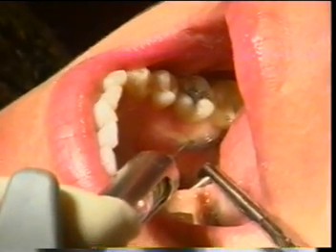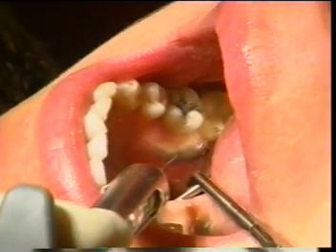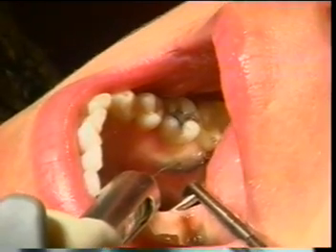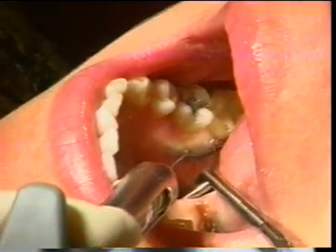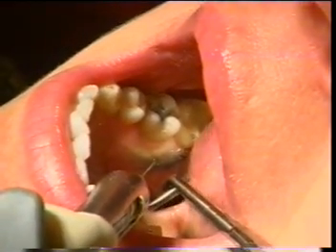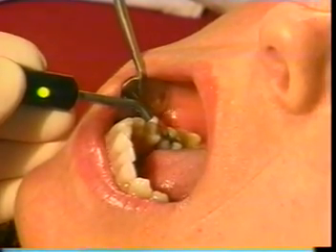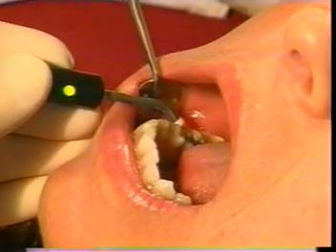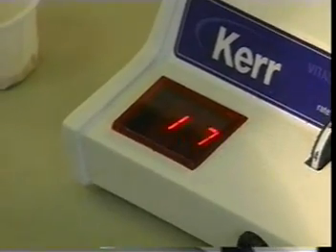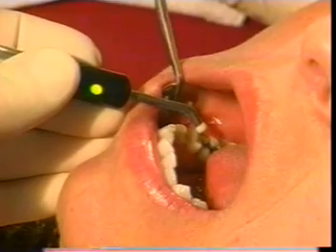It will be observed that there will not only be some blanching of tissue but also some tissue expansion. The volume of this infiltration will be approximately 0.7 cc. The Curve Vitality Scanner will deliver electric impulses to the anesthetized tooth on a scale from 0 to 80, with 50 being the mean assessment level for molars. The mean assessment level has been reached at just over 50 on the Curve Vitality Scanner.